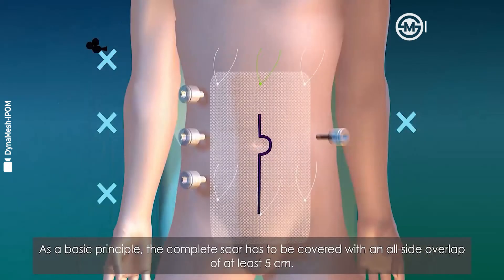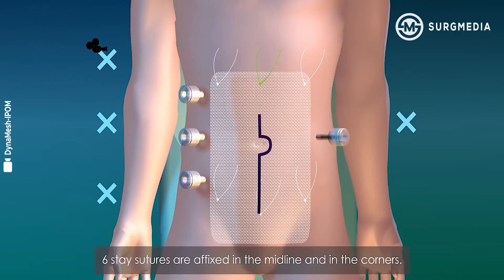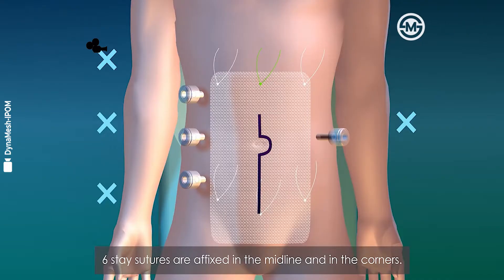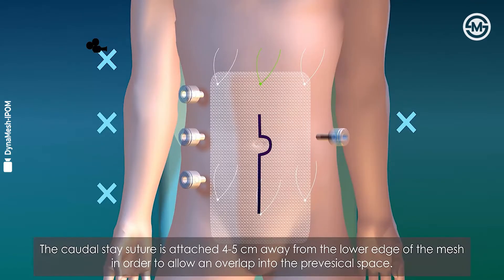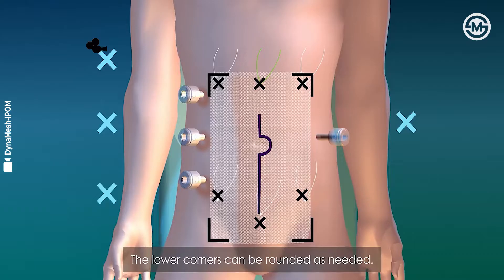As a basic principle, the complete scar has to be covered with an all-side overlap of at least five centimeters. Six stay sutures are fixed in the midline and in the corners. The caudal stay suture is attached four to five centimeters away from the lower edge of the mesh in order to allow an overlap into the pre-vesicle space. The lower corners can be rounded as needed.